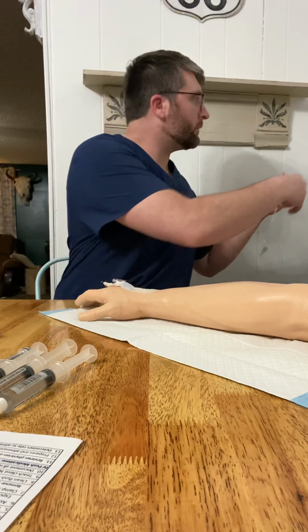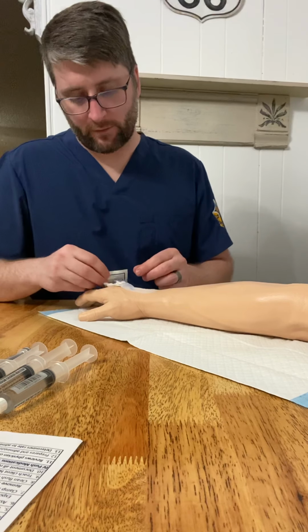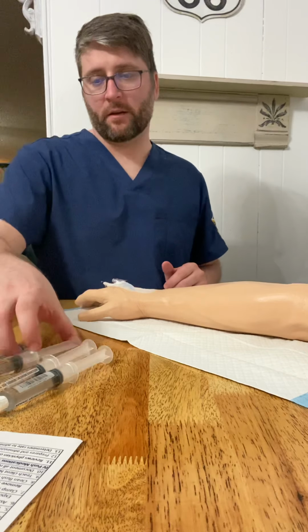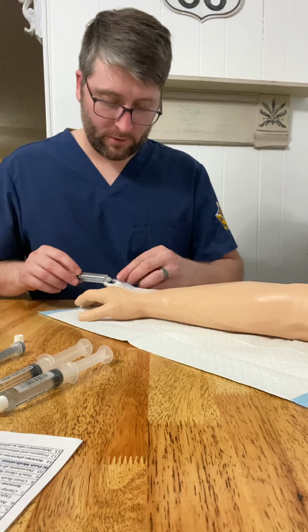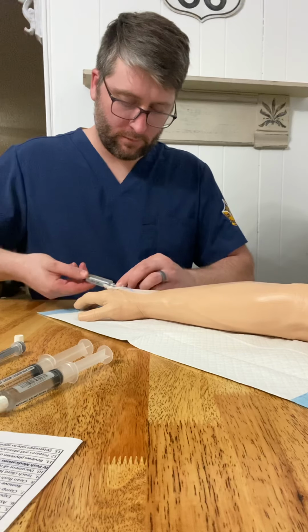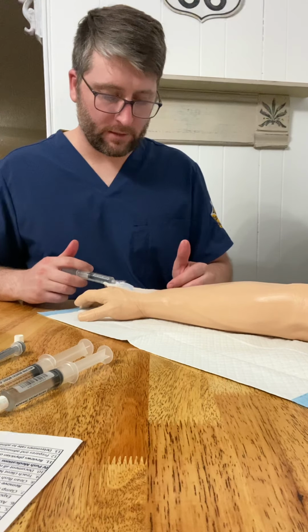All right, so at this time we're going to disinfect with an alcohol swab. I already have some gauze underneath that hub. I'm going to flush that line. We're going to flush, and we're going to make sure that it is still patent.